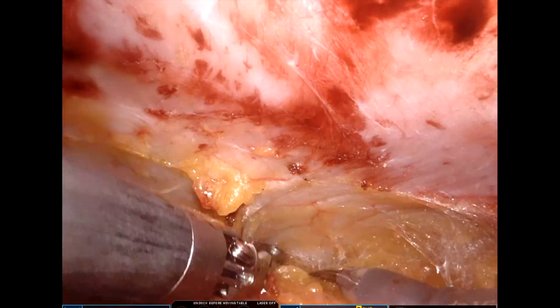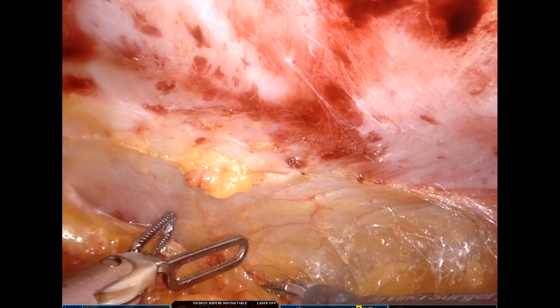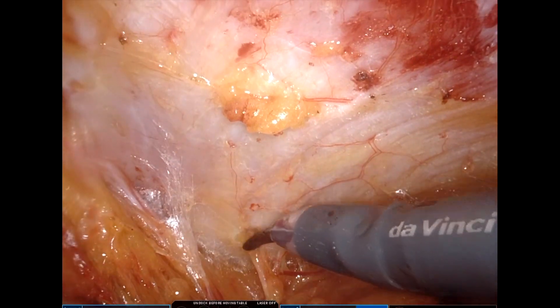The beauty of true pre-peritoneal dissection is that even a small defect in the rectus sheath like this one can be identified and dealt with.